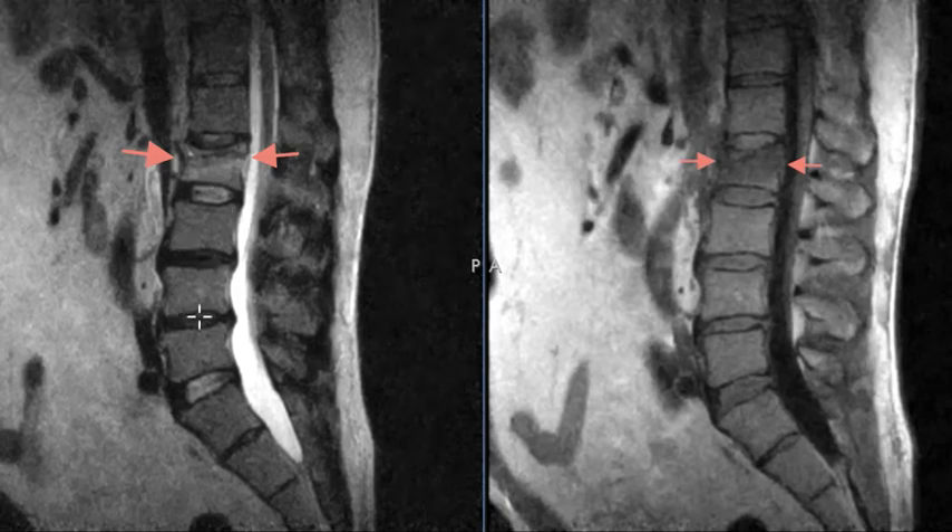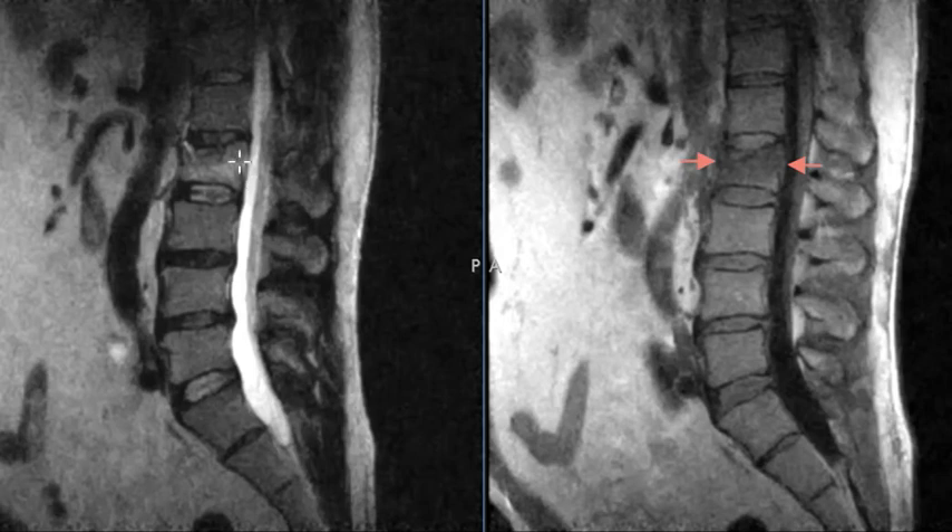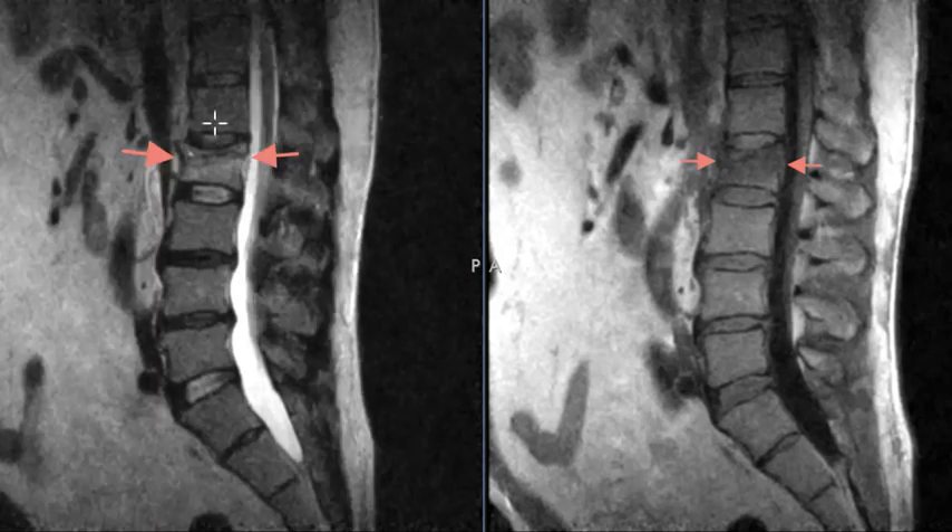They have a few other findings — a couple of disc bulges down here, but nothing dramatic. So this is a very common finding: an acute compression fracture of L2 with a little bit of anterior wedging. This is the anterior, this is the posterior, so the front kind of wedged a little bit. We see these with axial load injuries where they come down hard — like jumping off something, landing hard on a jet ski or four-wheeler. Also with car accidents, seat belt-type injuries a little bit higher where the body is folded forward can cause a similar compression deformity. So bread and butter — compression fracture. Thank you very much.